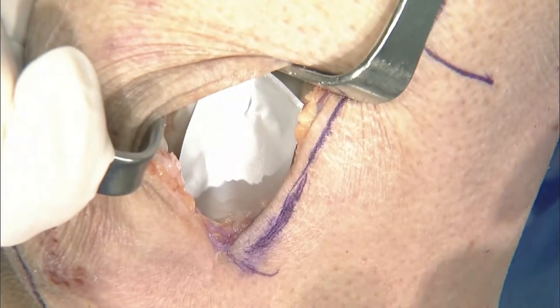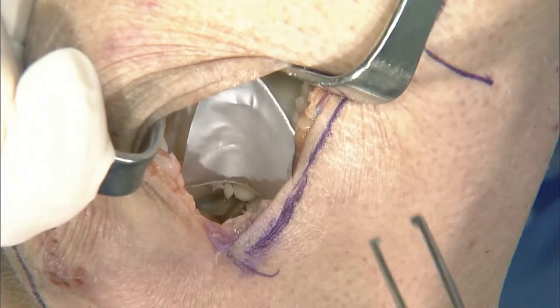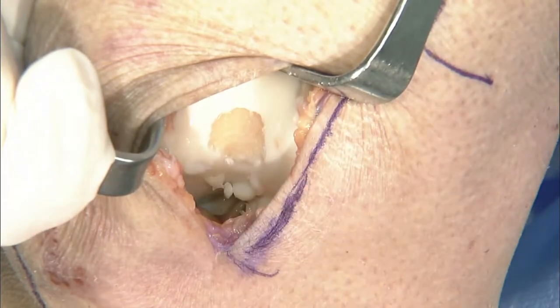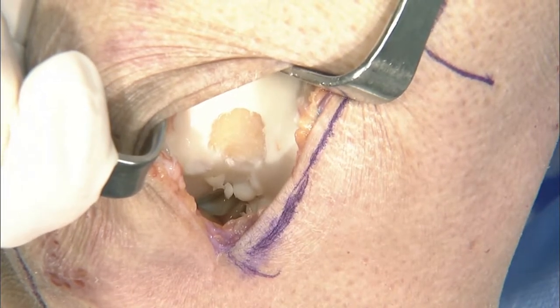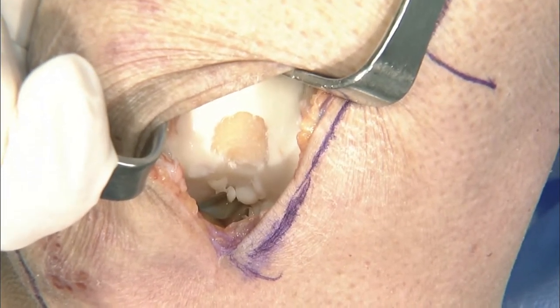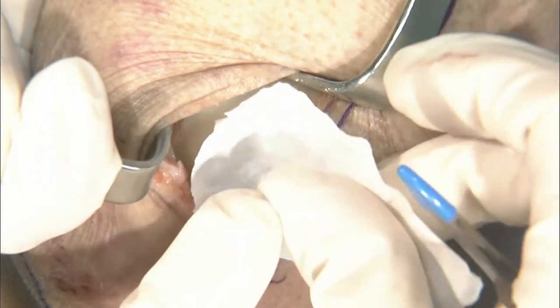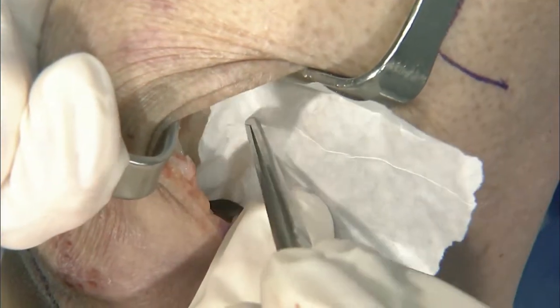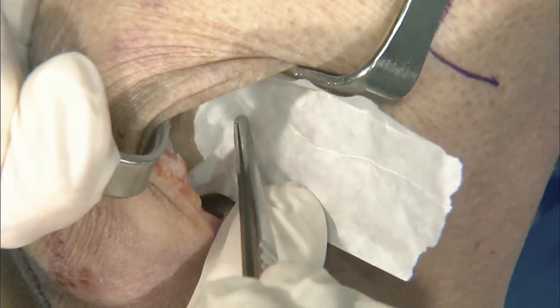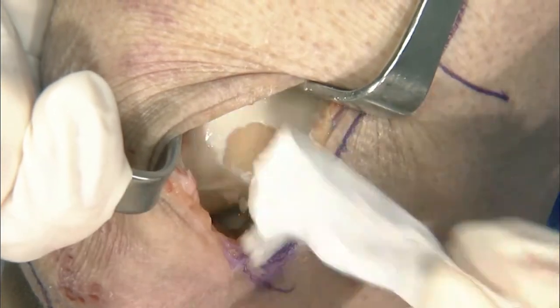Some of the other things that you can do are take a piece of glove paper, which is going to soak up a little bit more, and you're going to be able to see through that. Do we have a glove? So you can take a piece of glove paper and put that into the defect. And you can take a marker and see a little bit easier. You can create that defect size a little bit easier right here and take a marker around it if you want to do that.